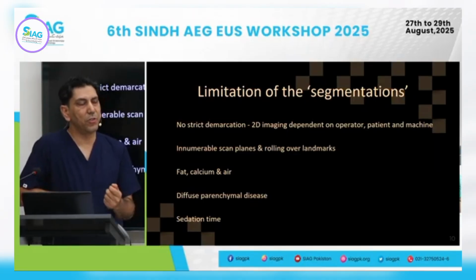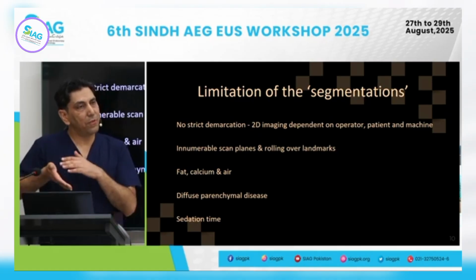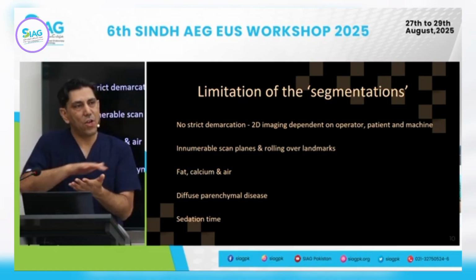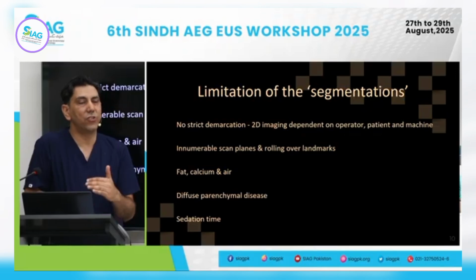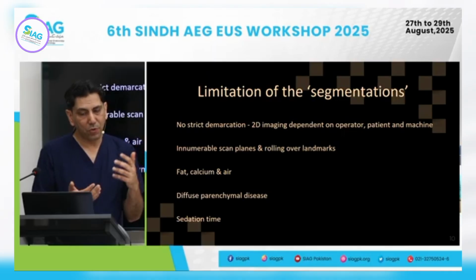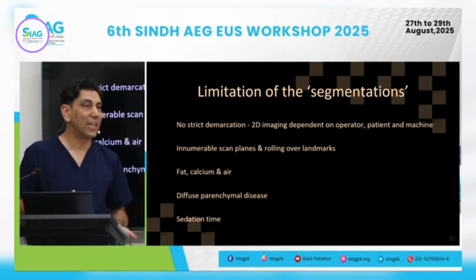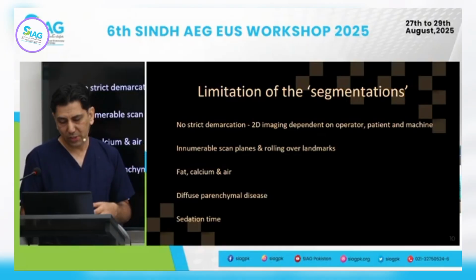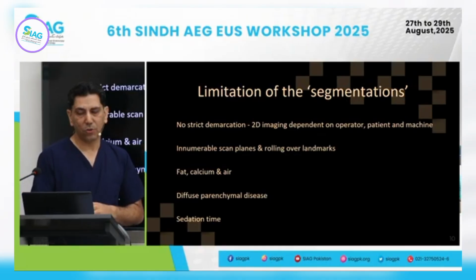You start by examining the GOJ, and as you advance, you are progressing from one area of examination to another. Therefore, the plane may change. When the plane changes, the orientation is going to change. That can cause a bit of confusion depending on the patient's body habitus, the machine, your presets, the underlying disease, and whether you're doing a patient under enhanced sedation or conscious sedation.